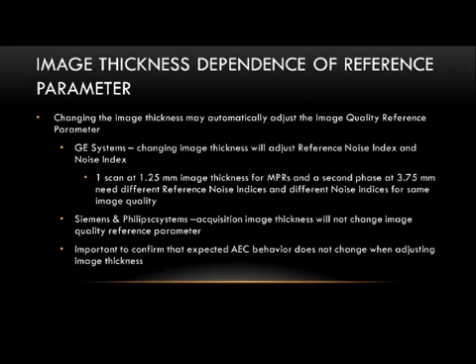It's got the same noise index as the first phase. Different acquisition image thickness, different behavior, and different implementation of the tube current modulation. So very important to remember.